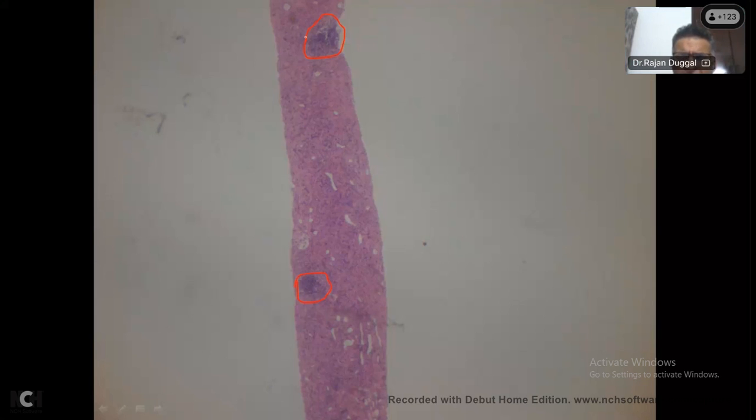One, you have said interstitial fibrosis could be there because it is more pink looking. What kind of infiltrate will be more pink looking? In any histopathology, I'm not talking about kidney biopsy, maybe lymph node, you can use any tissue.